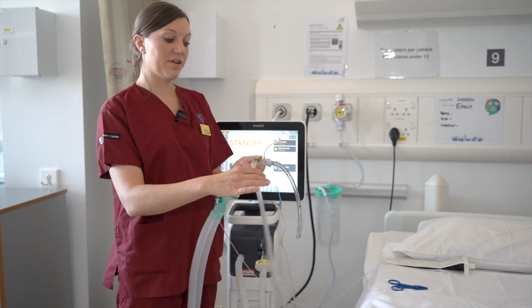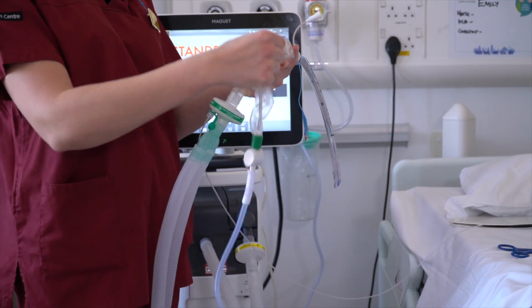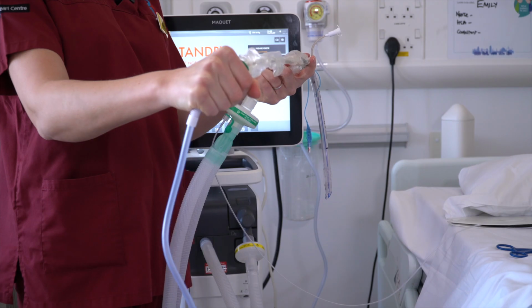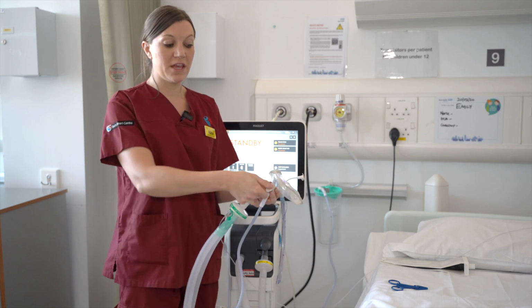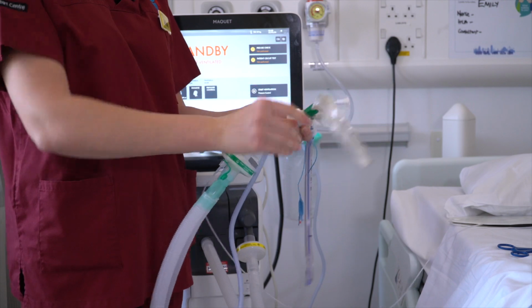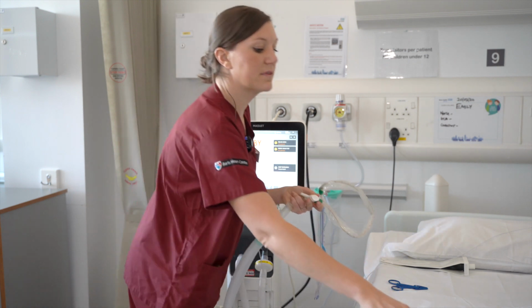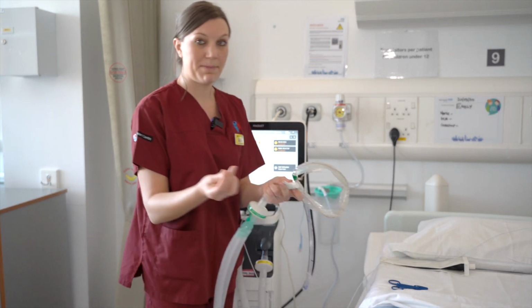From here, you can insert the suction catheter into the endotracheal tube, apply your suction and pull out gently. You must then make sure that you lift and twist the cap again, so it's no longer able to be depressed. Remove the suction and reapply your cap.